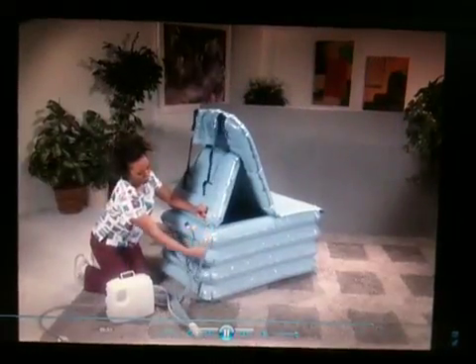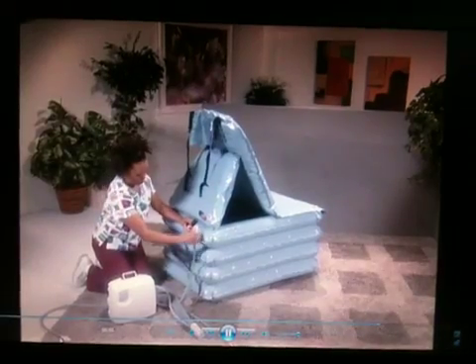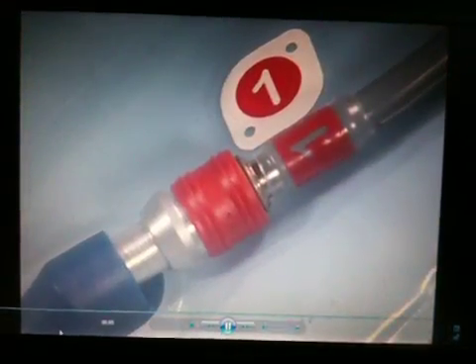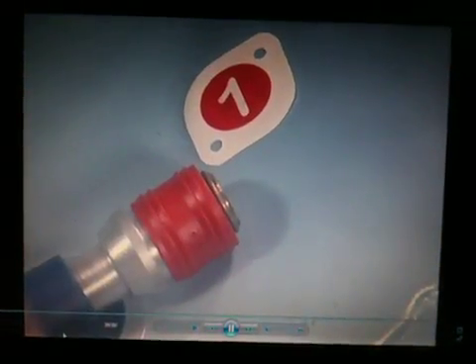The lift having been safely achieved, the camel can be deflated by simply removing the air supply lines that connect the camel to the compressor. To disconnect the air tubes, pull down on the color-coded collar, then pull the tube out.